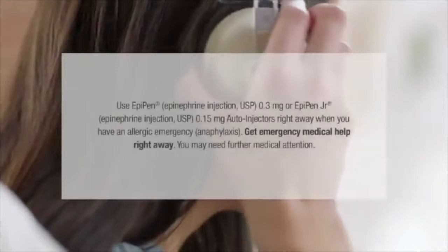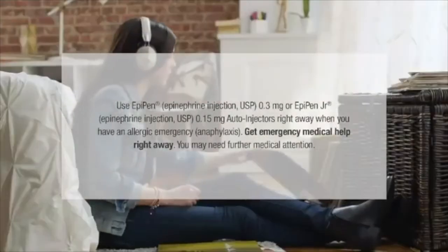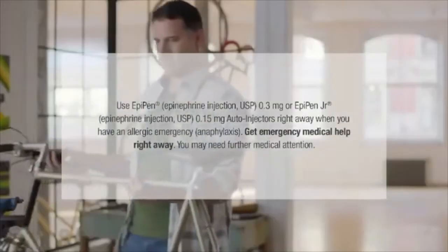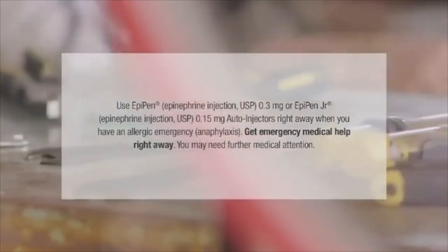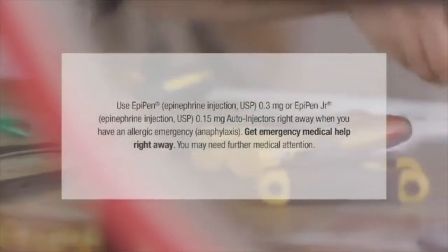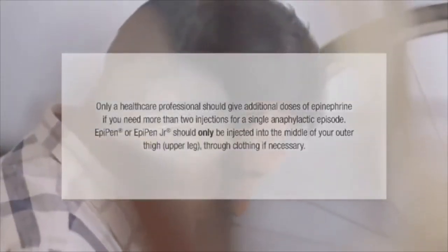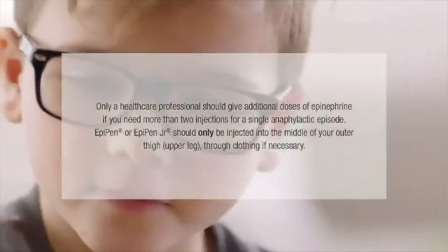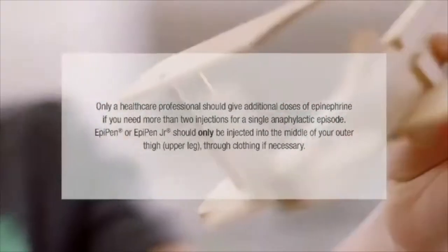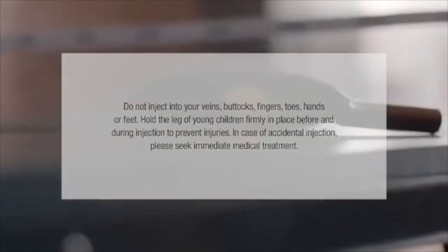Use EpiPen Epinephrine Injection USP 0.3mg or EpiPen Junior Epinephrine Injection USP 0.15mg auto-injectors right away when you have an allergic emergency — anaphylaxis. Get emergency medical help right away. You may need further medical attention. Only a healthcare professional should give additional doses of epinephrine if you need more than two injections for a single anaphylactic episode. EpiPen or EpiPen Junior should only be injected into the middle of your outer thigh through clothing if necessary. Do not inject into your veins, buttocks, fingers, toes, hands, or feet.